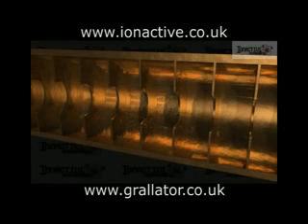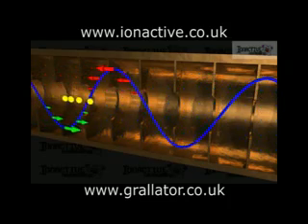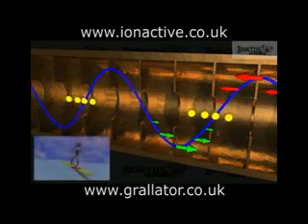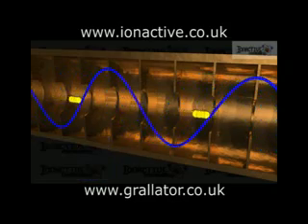The transfer of energy from the microwave field to the electron can be performed by two methods. The first method is to use a travelling wave, where the electric field traverses down the accelerator waveguide and the electrons ride the wave in a similar fashion to a surfer maintaining forward momentum from an ocean wave.